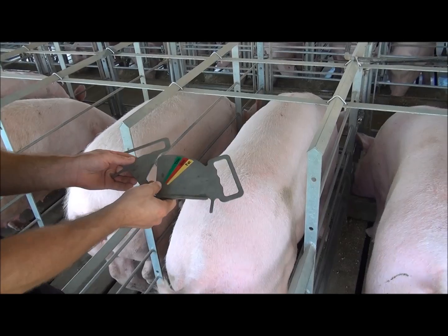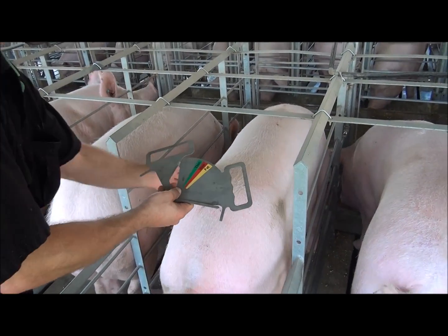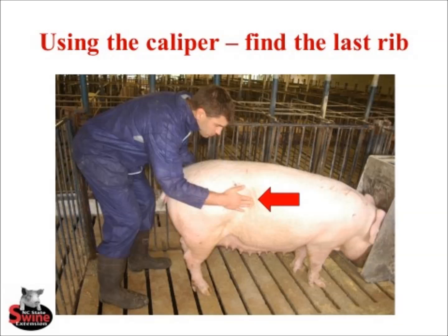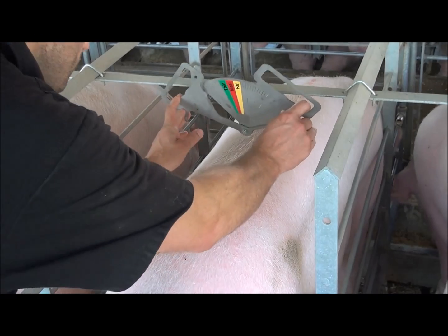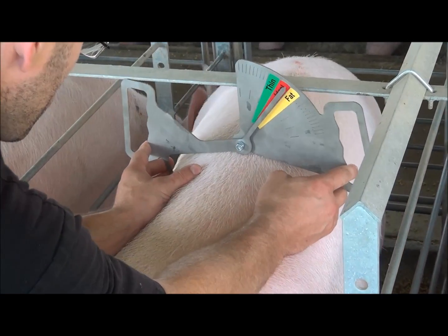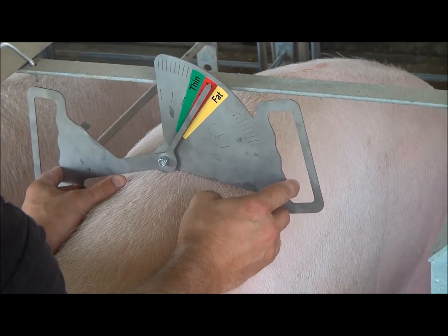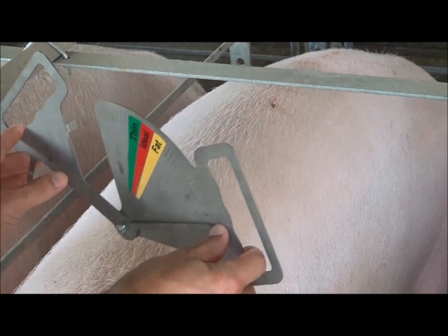The first thing I'm going to do is palpate for that last rib and put the caliper right over that last rib. Now after you've done about 500 sows or so, you're not always going to need to palpate for the last rib because you're pretty much going to know where it's at, and as long as you're within an inch or two, you're going to be okay. I find that last rib, bring the tips of the caliper down so they just touch the sow, and I can see that this sow is in ideal body condition.